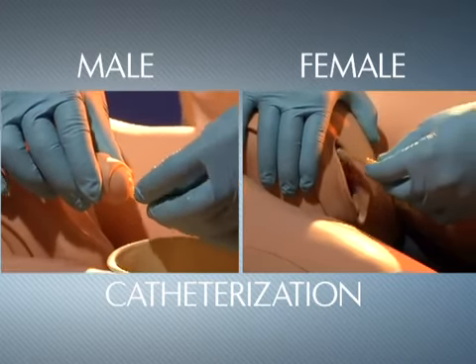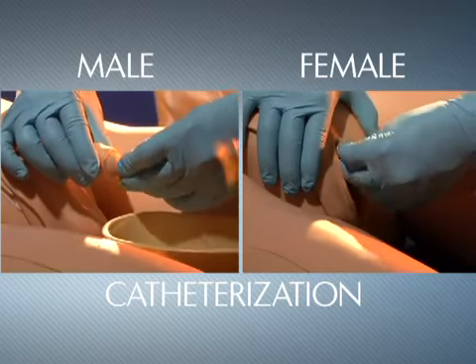HAL can be catheterized via exchangeable male and female genitalia.